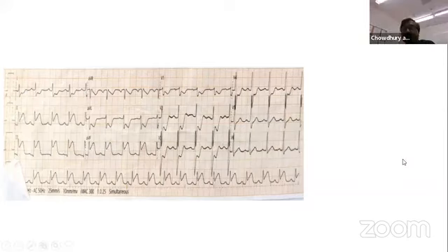Right. So this has long been believed, and there was a publication last year that the magnitude of ST elevation is associated with prognostic implications. If you recall, and I can see Shafiq Bhai and Professor Azam and Wadud, in interventional cardiology, the more the ST elevation, those patients have higher incidence of VF arrest.